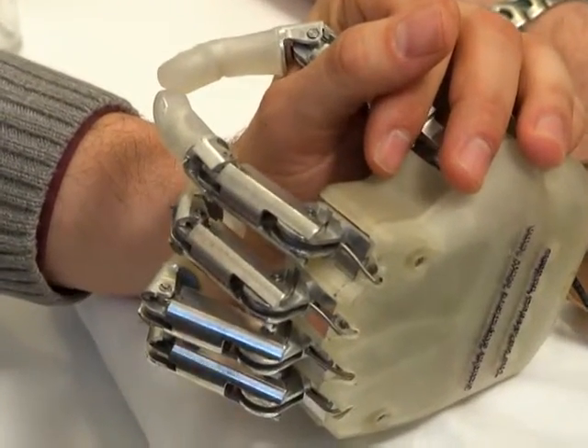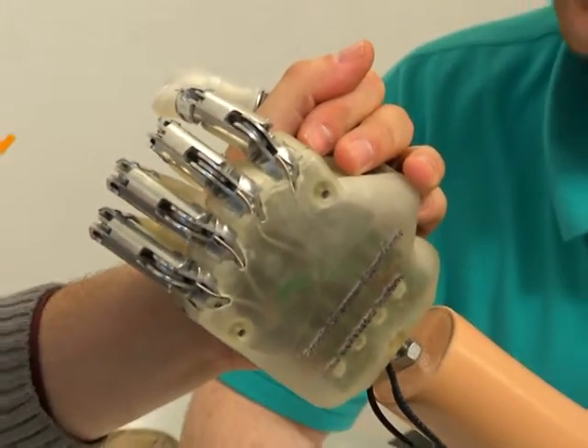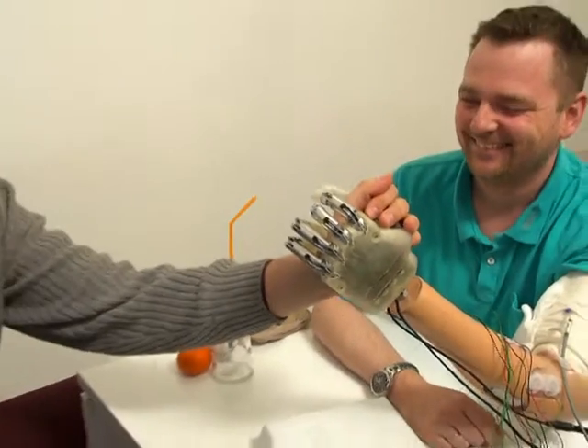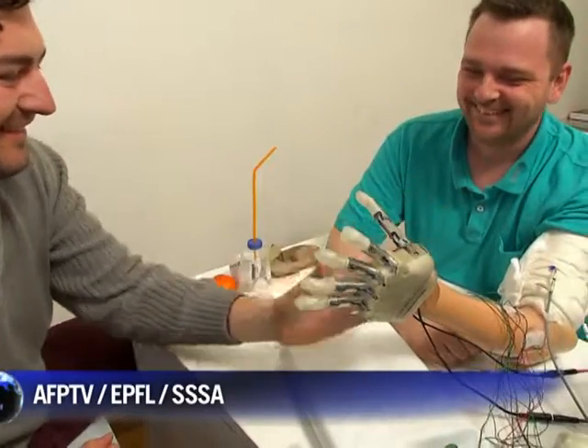Can you go without this? Open. Open. Okay.